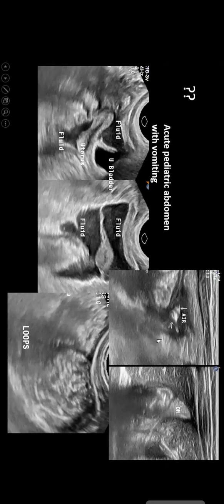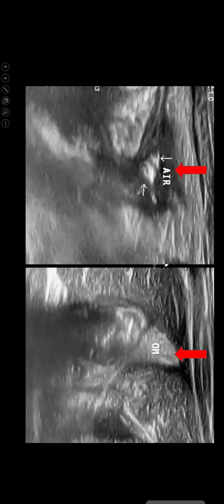So basically on ultrasound, what we can see is a focal peritonitis with omentitis, extraluminal air, a focal pneumoperitoneum suggestive of some ileal perforation with peritonitis and adhesion causing small bowel obstruction. This is what we can predict by ultrasound evaluation of this patient. Again, zoomed images. This is air.